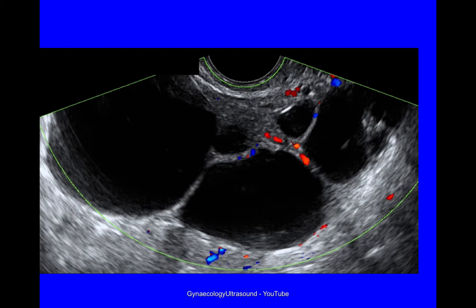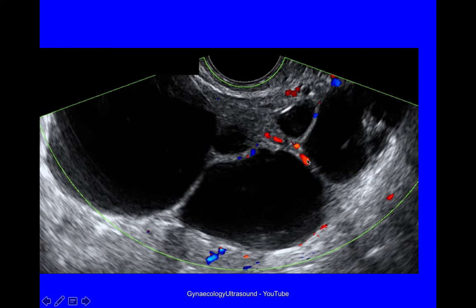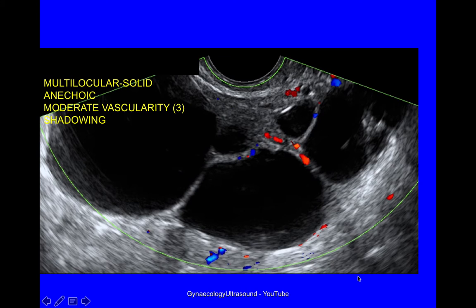This cyst looks slightly different — more than 2 locules, multilocular, with a little bit of solid material in its centre, anechoic cyst contents, moderate vascularity with a score of 3, and a little bit of shadowing. So this cyst is different to the ones seen before, but it is a serous cystadenoma proven on histology. It is multilocular solid, with anechoic contents, moderate vascularity, and shadowing.